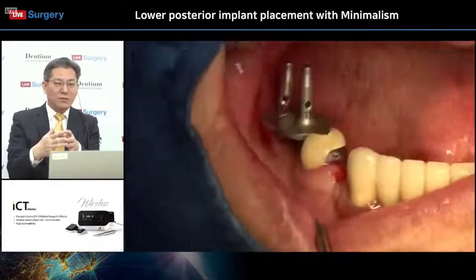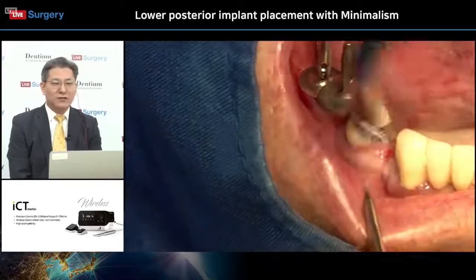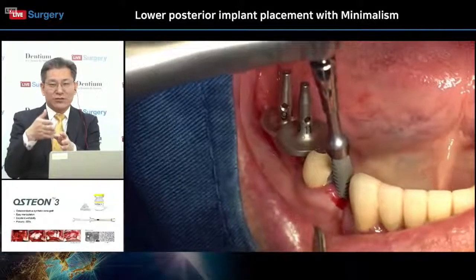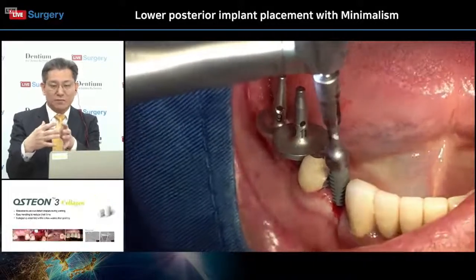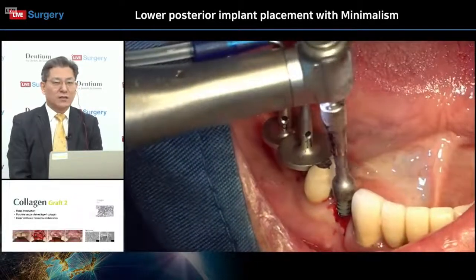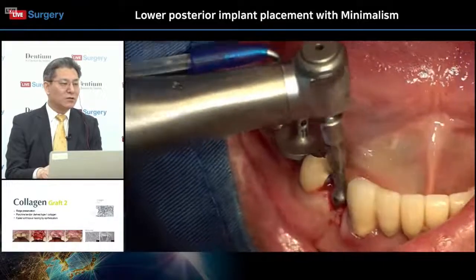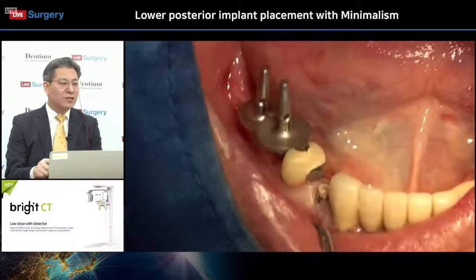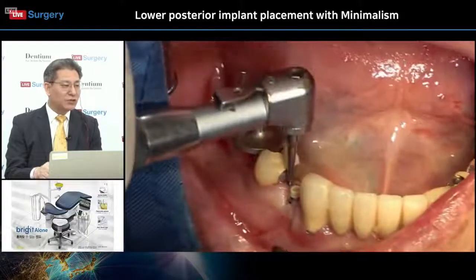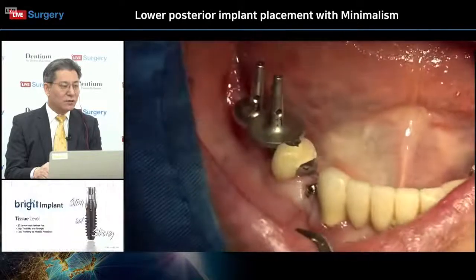If we make the insertion at this point with the implant fixture, the center portion of the final restoration, the central groove or functional cusp of the final restorations, can be kept. So, checking all this three-dimensional view, three-dimensional position, and starting implant insertion.